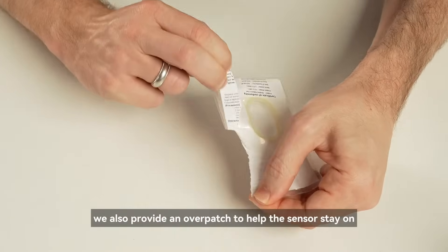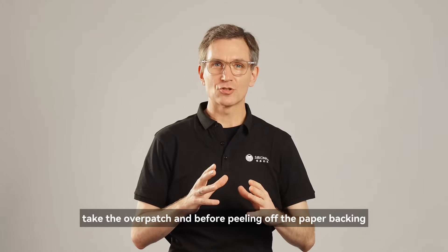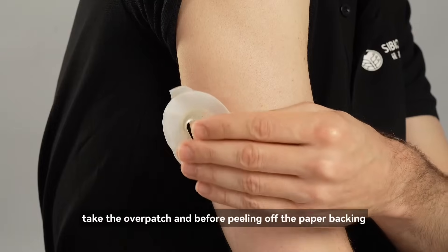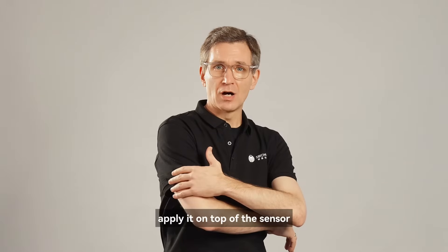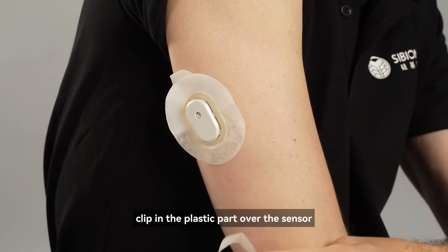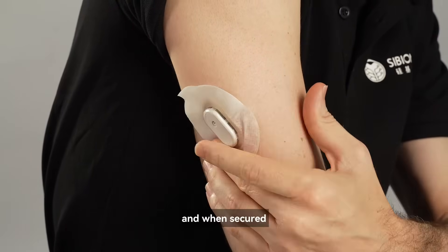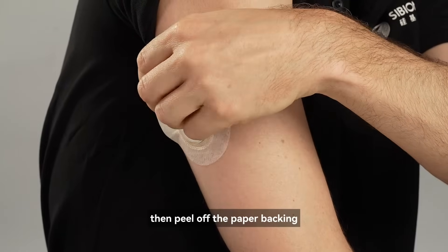We also provide an overpatch to help the sensor stay on for longer. Take the overpatch and before peeling off the paper backing, apply it on top of the sensor. Clip in the plastic part over the sensor and when secure, then peel off the paper backing.